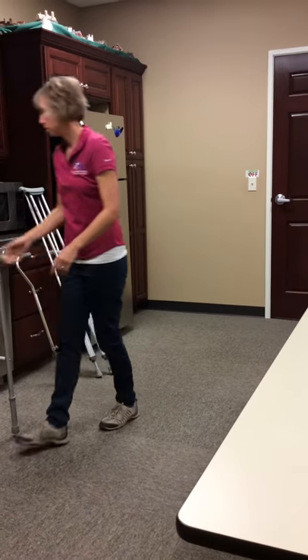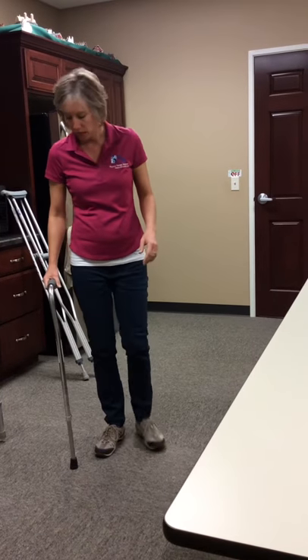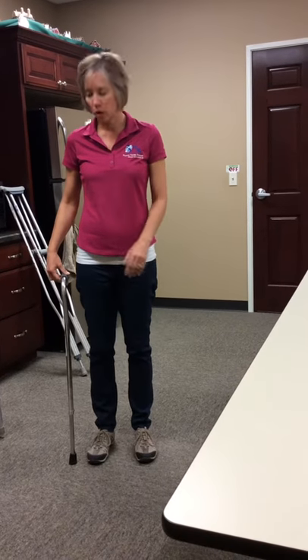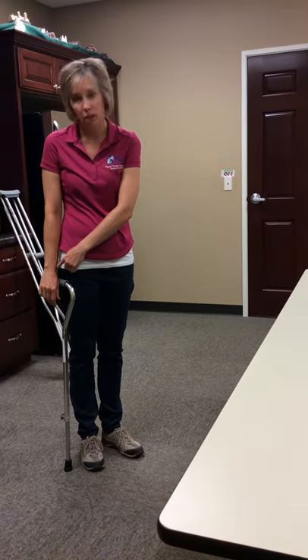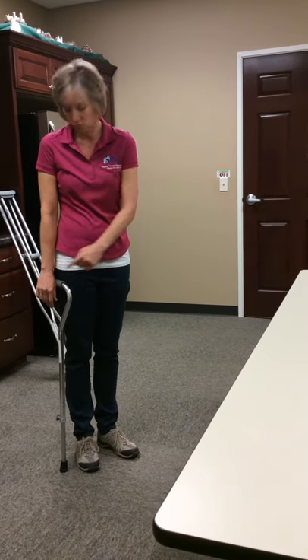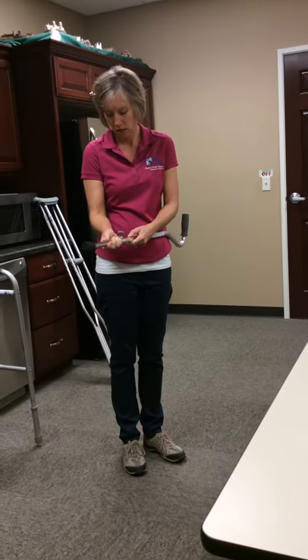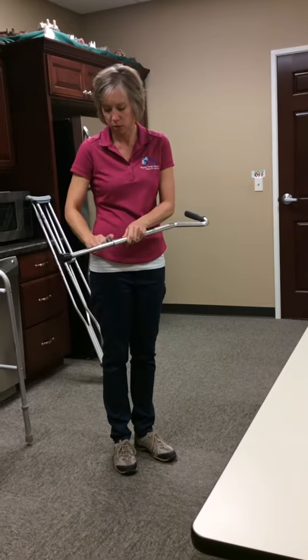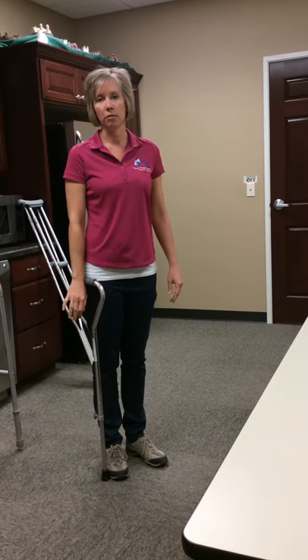If you don't need as much support as a walker provides, you can use a cane. The cane is fit the same way — hold the cane by your side, let your hand rest, and it should come to your wrist. As you can see, this one is a little bit short, so I just need to make a small adjustment. I'll raise it up a couple notches to fit my height, and now it comes to my wrist.